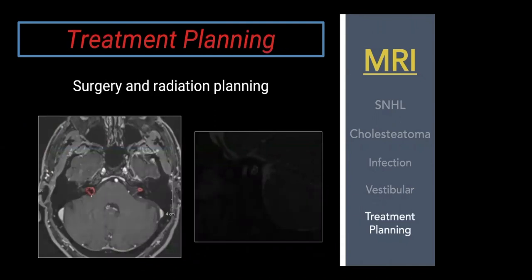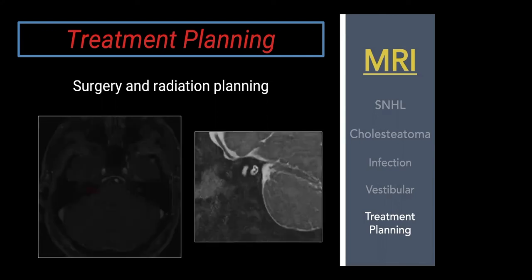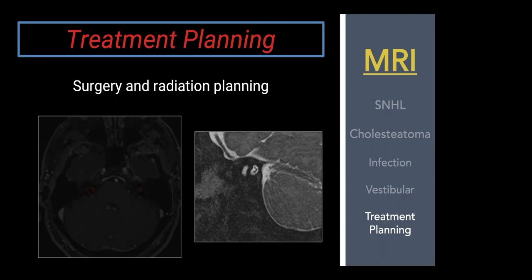For treatment planning, MRI is better than CT for following masses and tumors and for radiation planning. Here, bilateral vestibular schwannomas in a neurofibromatosis type 2 patient are contoured to track volumes and plan radiation. In another case — a child with congenital sensorineural hearing loss — the fluid-sensitive sequence is reformatted down the barrel of the IAC. We look for the four main nerves: a clear facial nerve, superior and inferior vestibular nerves are present, but virtually no cochlear nerve, which has significant treatment implications.